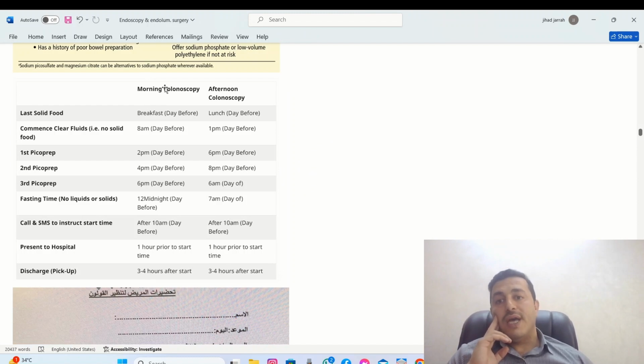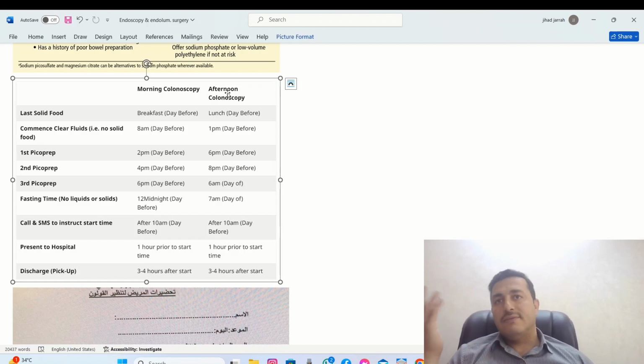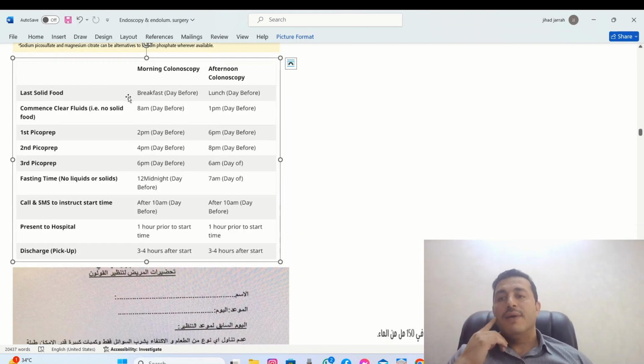It depends. Do we have a morning colonoscopy at 8 or 9 o'clock, or a late colonoscopy at, for example, 1 p.m. or 2 p.m.? Let's take the morning colonoscopy as a standard.